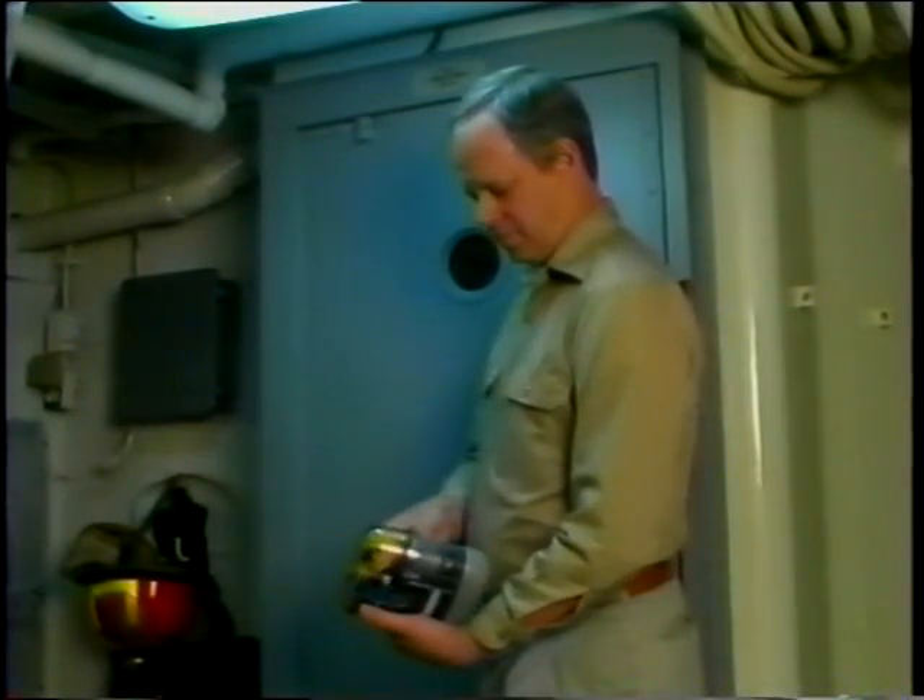To ensure your Osinko EEBD is in quality working condition, check the pressure gauge. If the white indicator needle does not appear in the green zone, remove the Osinko EEBD from service. If the surrounding air temperature is above 100 degrees Fahrenheit and the needle is above the green zone, allow the unit to cool down to room temperature between 65 to 75 degrees Fahrenheit.